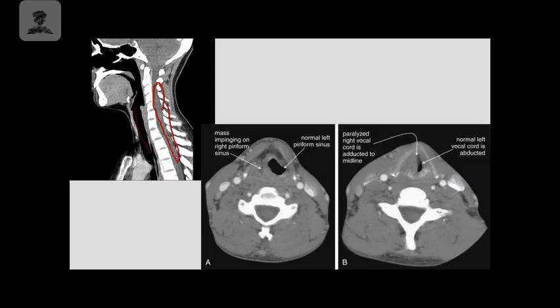In the axial plane, you can actually see the vocal cords. This patient has had contrast, and I know that because I can see the carotid arteries and the jugular veins on there. But we can also look at the C spine. So there's a lot of imaging that we can look at in the neck region.